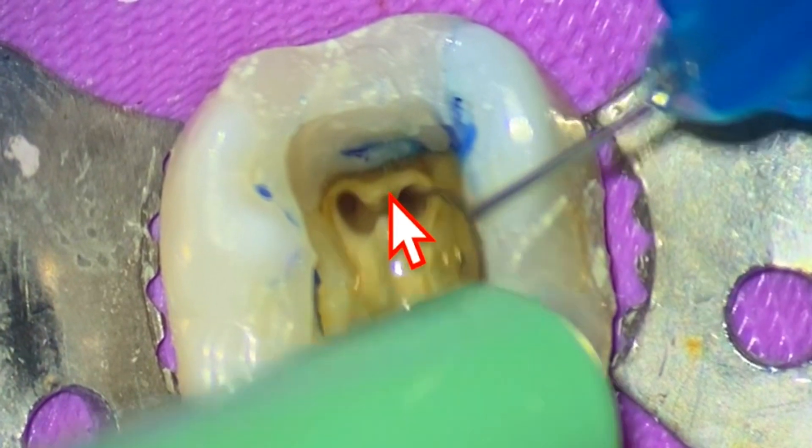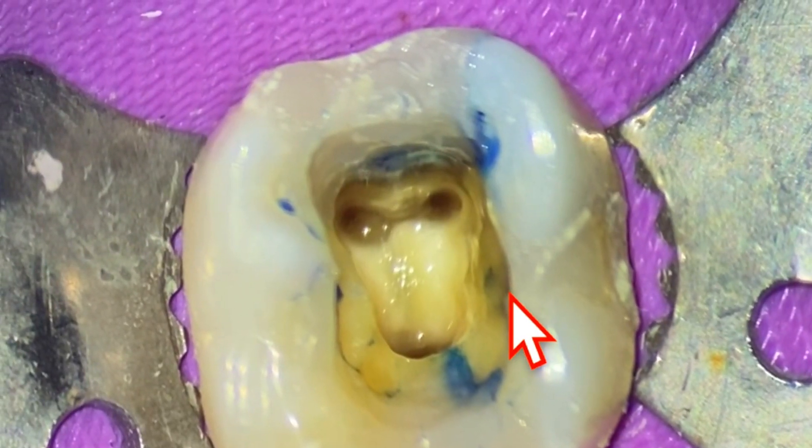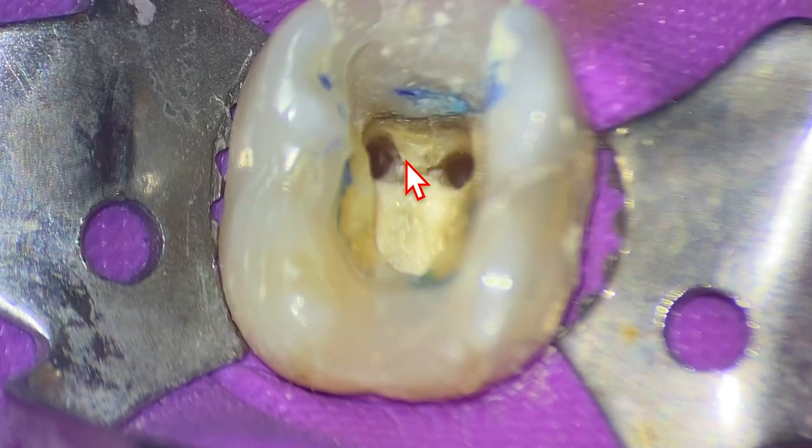You need to make sure that there's not a middle mesial canal. Now in most of the literature, I would say on average the middle mesial canal is present in about 15% of cases. And here we are right here.